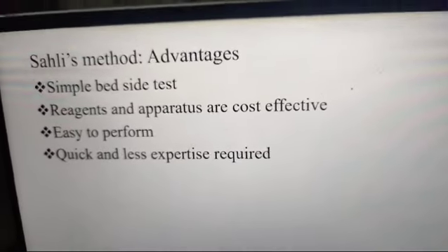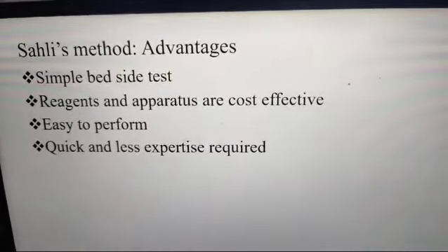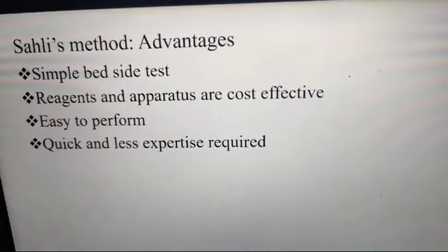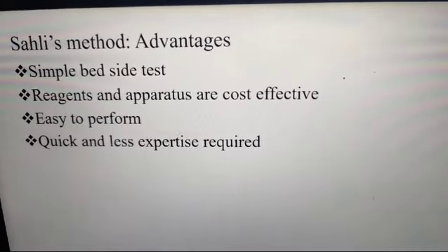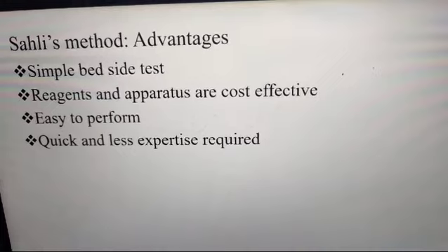The main advantages of Sahli's method, even though it is not ideal: it is a simple bedside test. The reagents and apparatus are very cost effective, easy to perform, quick and less expertise is required.